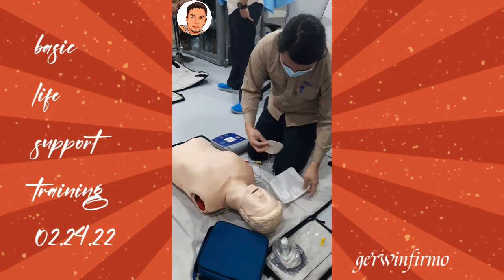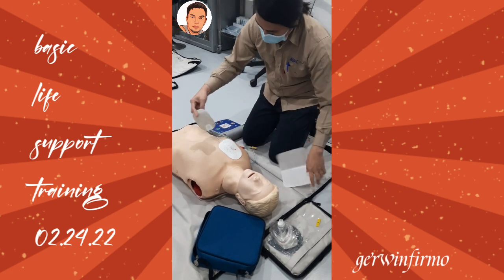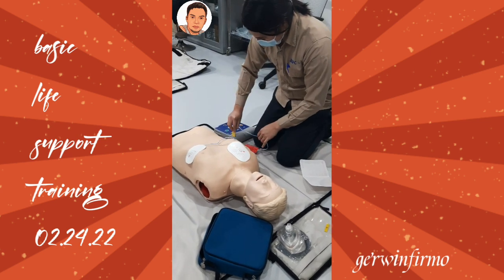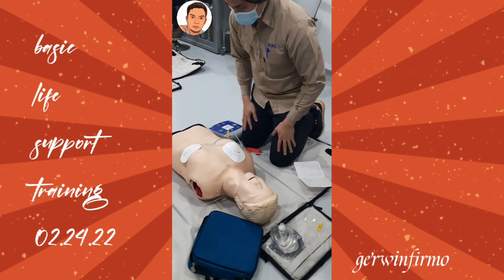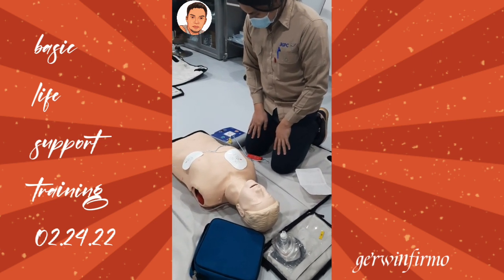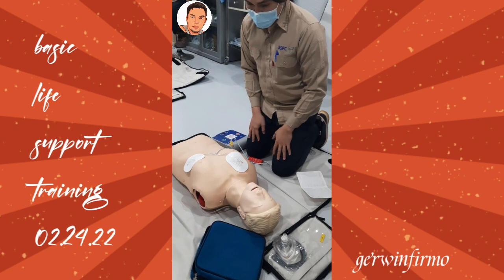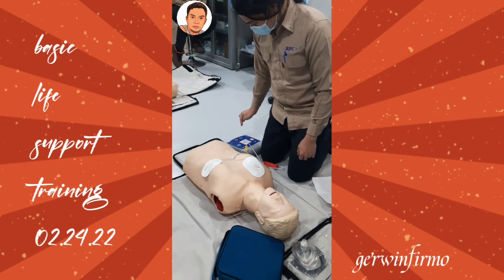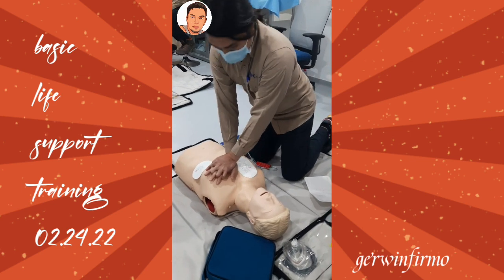Okay, apply pads. Apply pads to patient's bare chest. Plug in pads connector next to flashing light. Analyzing heart rhythm. Clear. Do not touch the patient. Shock advised. Charging. Stay clear of patient. Everybody's clear. All clear. Deliver shock now. Press the orange button. Shock delivered. Pause. Continue CPR. Begin CPR.